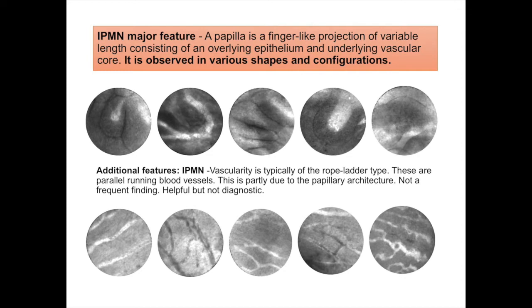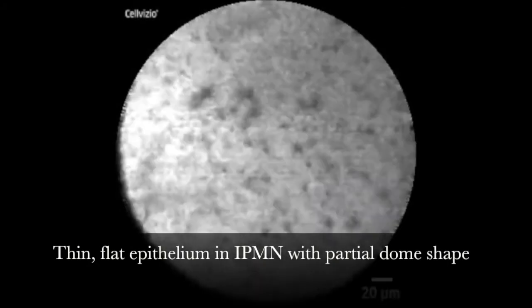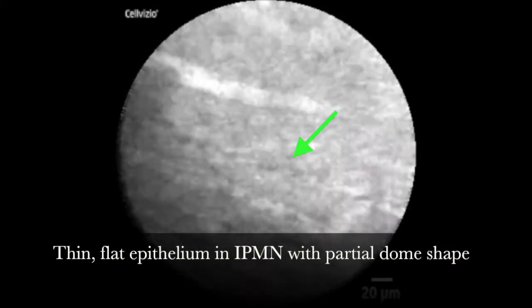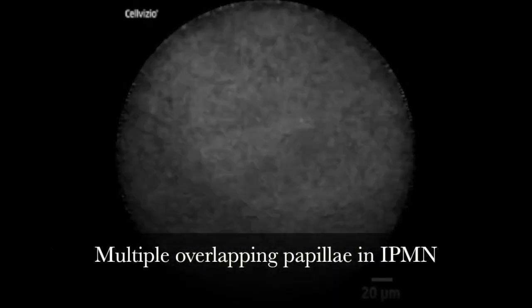when we evaluate IPMNs. Another point to be noted is that we rarely see isolated or large papillary structures, since most IPMNs are somewhere between low-grade, intermediate, proceeding to high-grade dysplasia. As dysplasia progresses, we get to see these large papillary structures, sometimes which occupy the entire field of vision. Here in these videos, you see much flatter, thinner epithelium, a feature of IPMNs with low-grade dysplasia, and you will see IPMNs with multiple papillae. It's overlapping papillae as seen in this video.